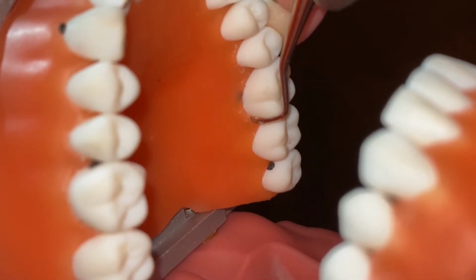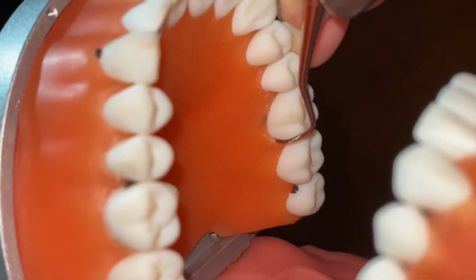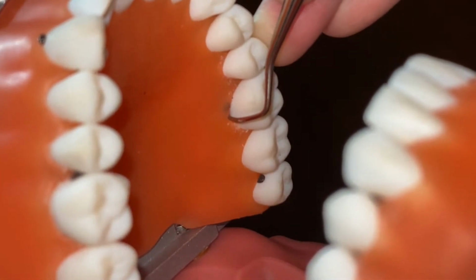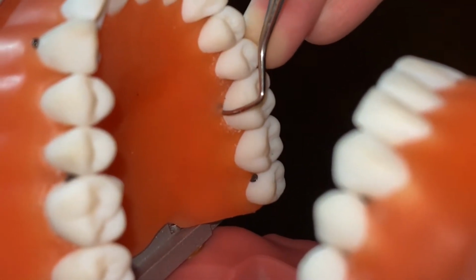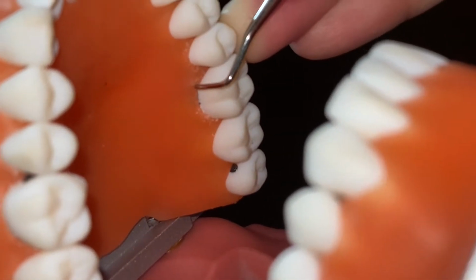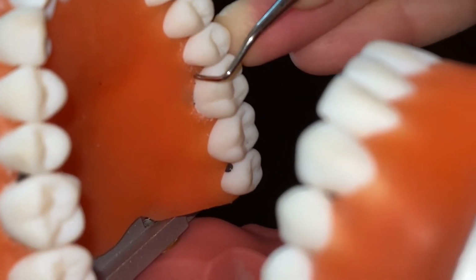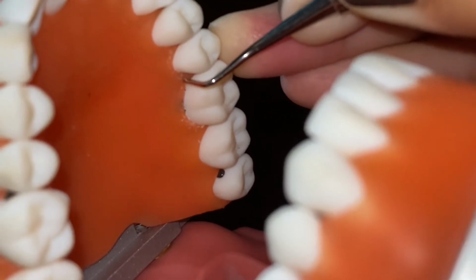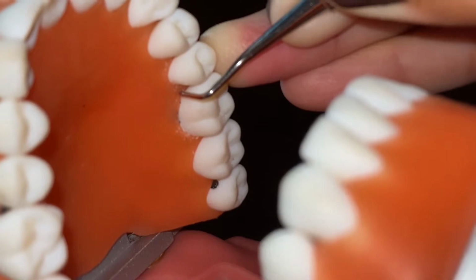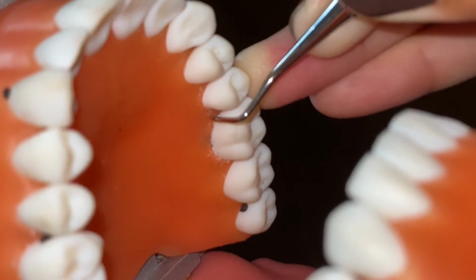Keep making sure that that corner of that toe of your blade is adapted towards the tooth, and then up, down, up, down, pivot, roll, and then in the interproximal, just moving your elbow up and down to scale the mesial surface of tooth 14.